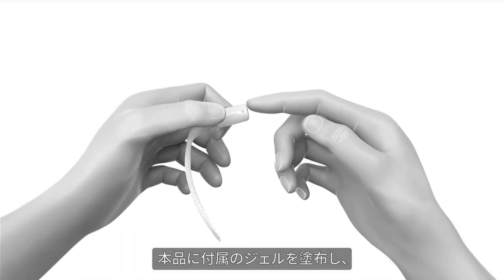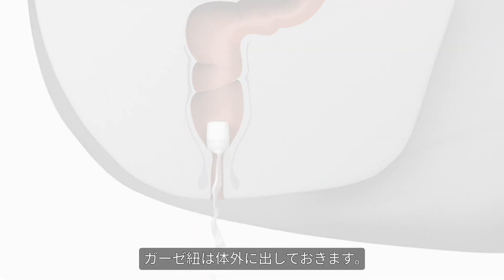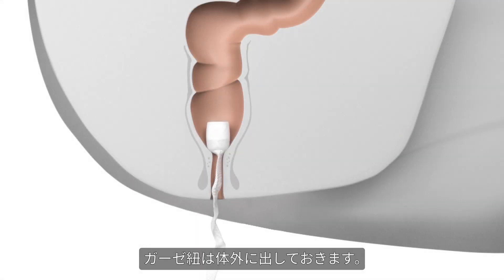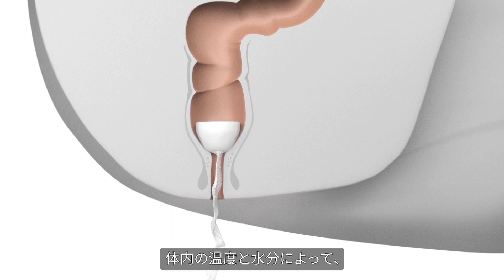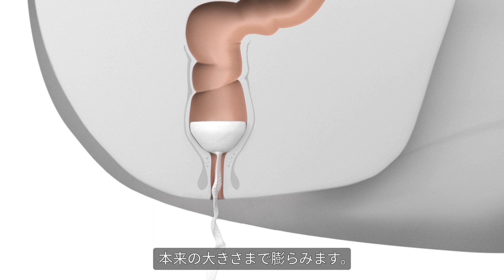Peristeen anal plug needs to be lubricated and then inserted as a suppository, leaving the gauze outside the body. Once inserted in the rectum, it will expand to full size and the film dissolves in the body's natural warmth and moisture.